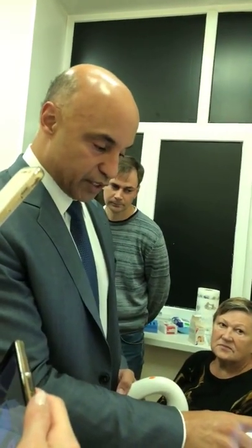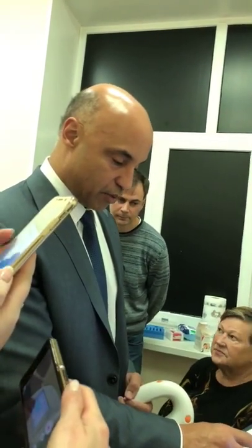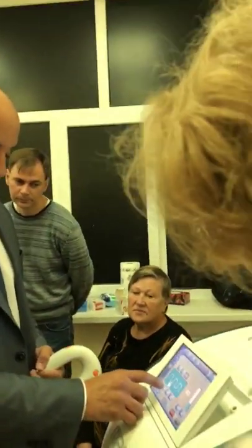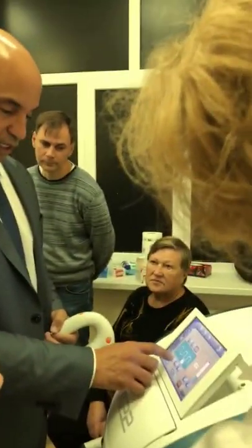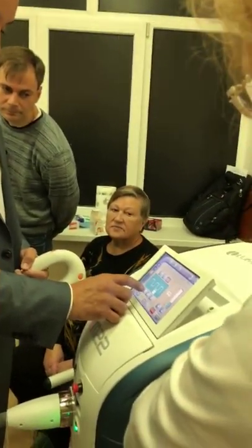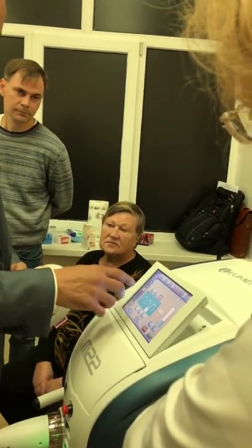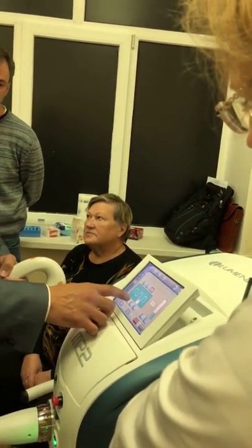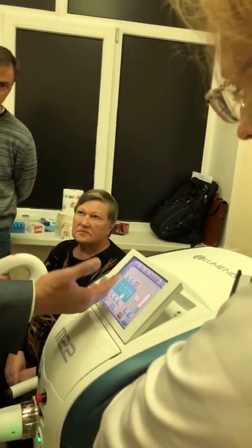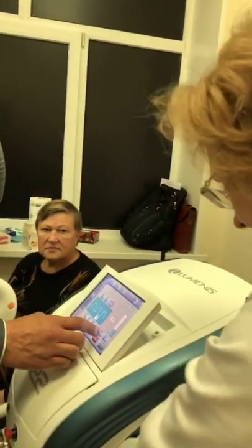And what we're going to do is we're going to give it 6 milliseconds of on pulse. And then what we're going to do is go to 50 milliseconds of thermal relaxation time. So what it's saying is we're giving 6 milliseconds of 14 joules. Then we're going 50 milliseconds of thermal relaxation time before we give them another 6 milliseconds of 14 joules onward. Ну да, получается 6 миллисекунд.